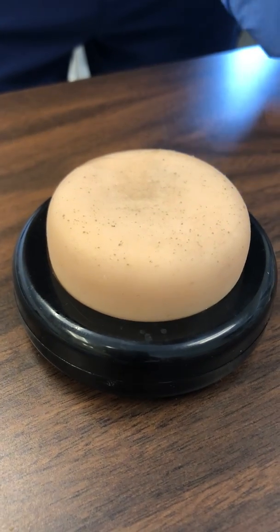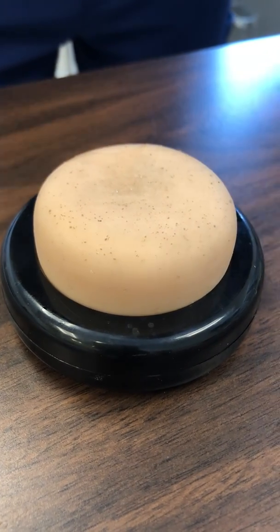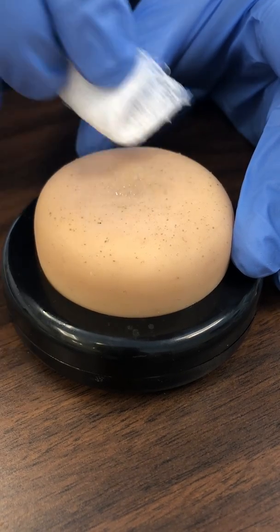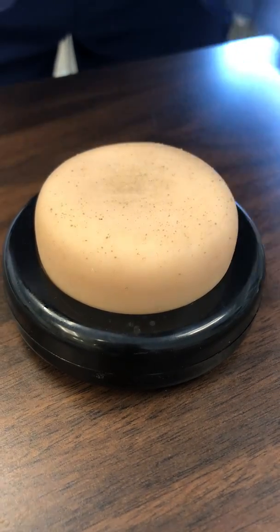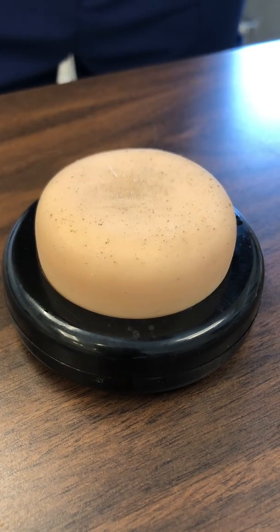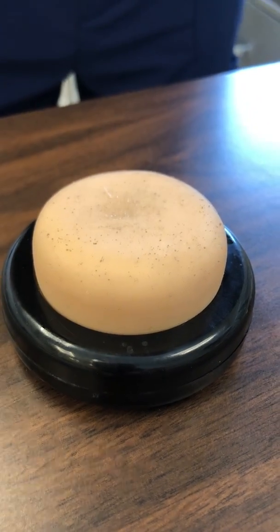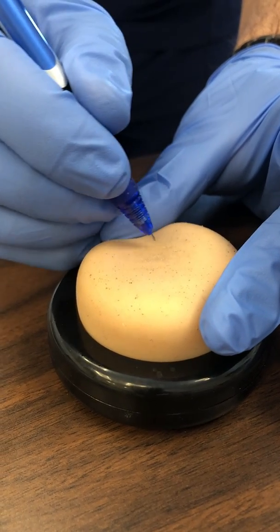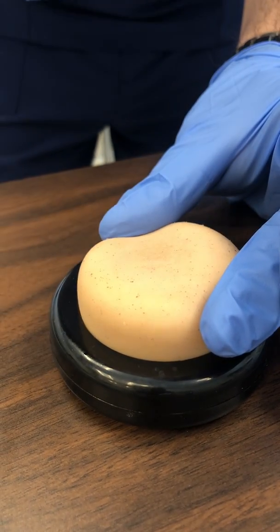Now, I'm not going to put a Band-Aid on or wipe with pressure, but I am going to blot any blood or medication that may have come out. At this point, I'm going to take a pen or a Sharpie, and I am going to draw a circle around where the injection was.